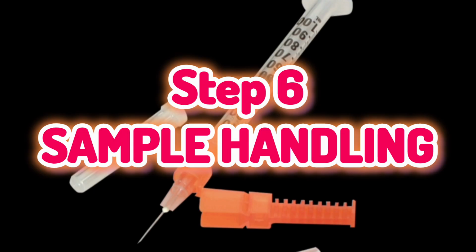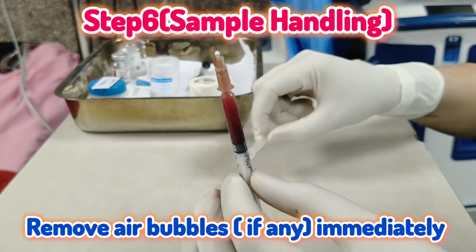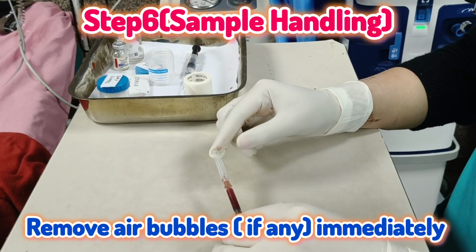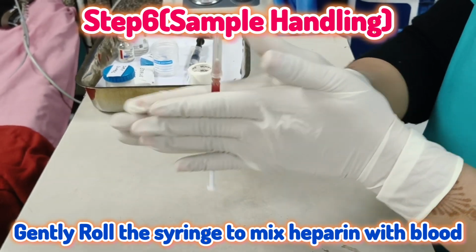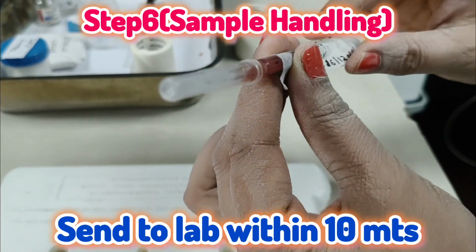Step 6. Sample handling. Remove air bubbles immediately. Why? Because air bubbles contain more oxygen, so they can generate false or inaccurate results like high PaO2, the pressure of arterial oxygen, and low PaCO2. Gently roll the syringe between the palms to mix blood with heparin, but do not shake it. Label the sample and send it to the lab within 10 minutes.